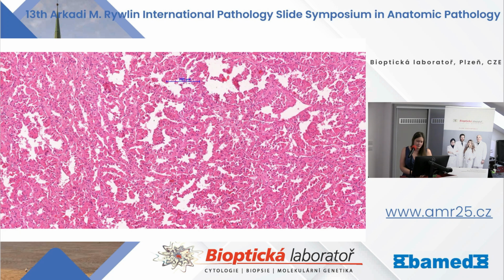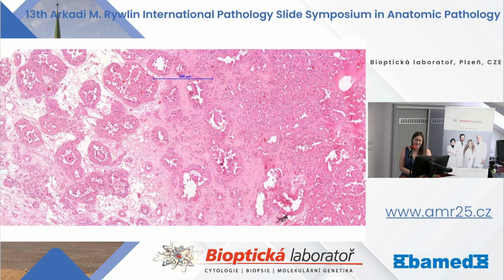So you can see that the tumor is composed of eosinophilic cells, homogeneous eosinophilic cells, with relatively small nuclei and with pseudostratification. Here you can appreciate the presence of papillae which are lined by these cells. In some parts of the tumor, you can see again the renal oncocytoma-like growth pattern, so you can see an edematous area, and on this edematous background you see nested architecture.